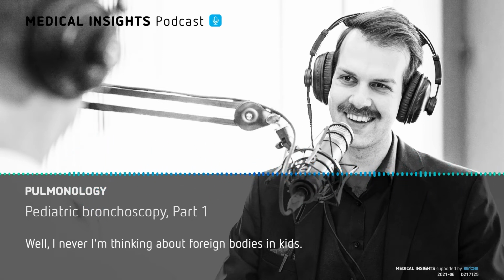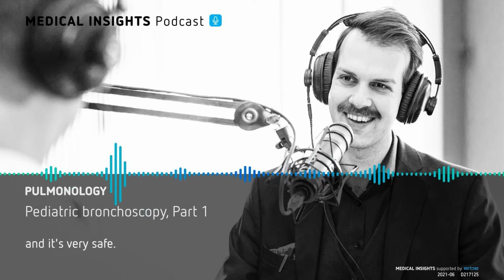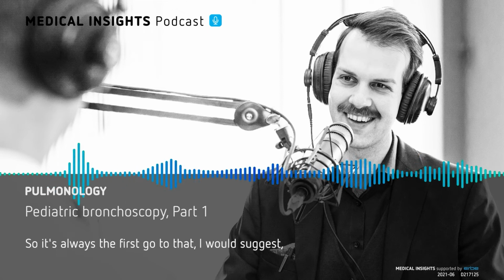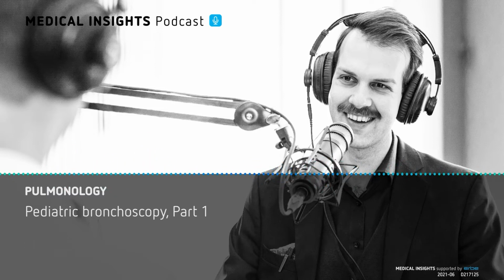Well, whenever I'm thinking about foreign bodies in kids, my first go-to is always going to be rigid bronchoscopy. Rigid has been used for years and years, and it's very safe. It's very effective. We have tons of data on this. So that's always the first go-to that I would suggest for trying to remove foreign bodies, whether frankly in kids or in adults. But it certainly works very well.